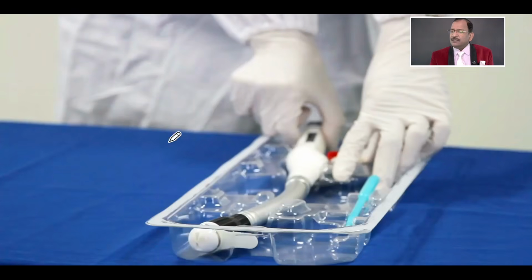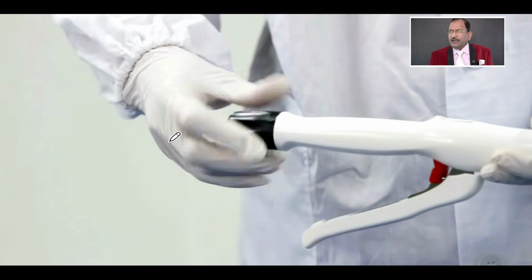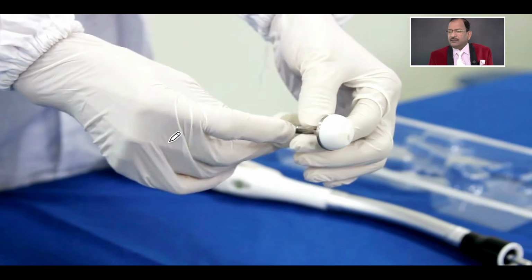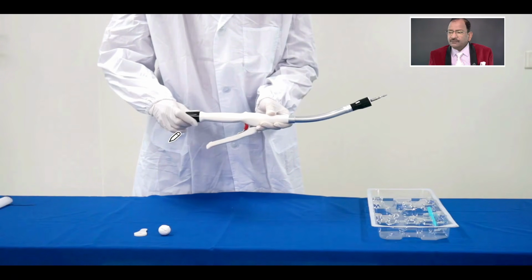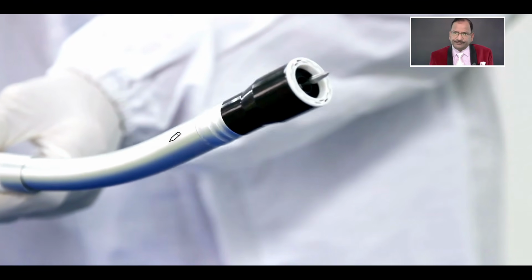So seeing the circular stapler is very important, and we can see there are many types of circular staplers. Different companies are making them, Lotus is making, Ethicon is making, Covidien is making, but the main features are the same. This is perforated.